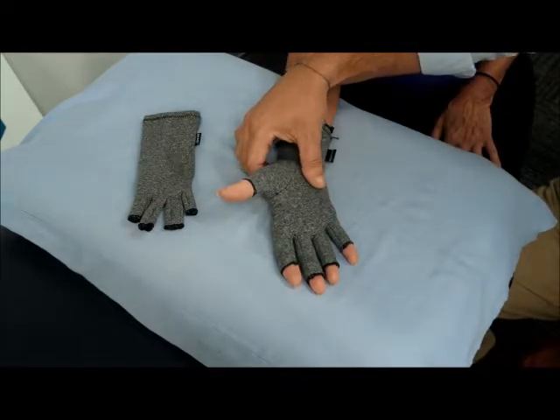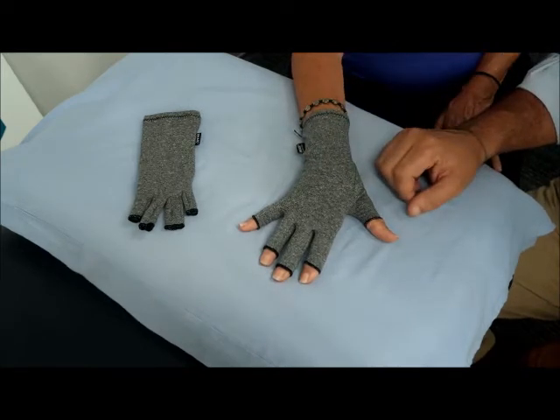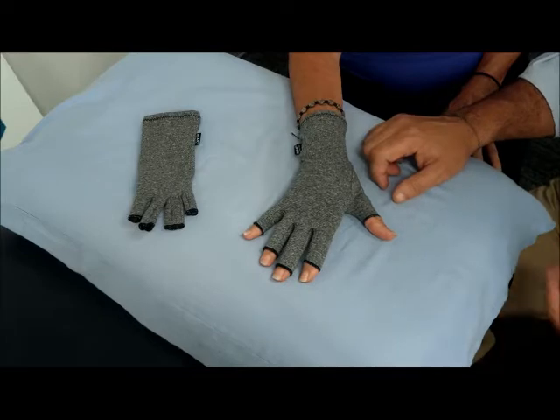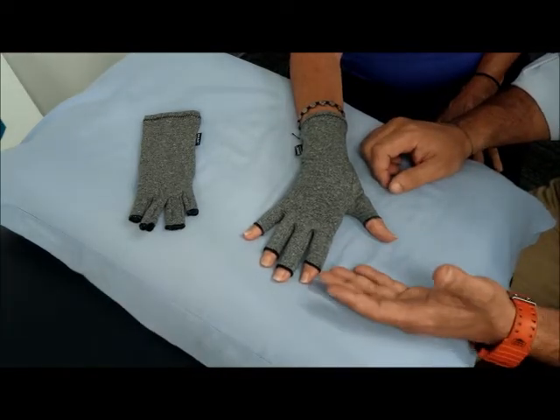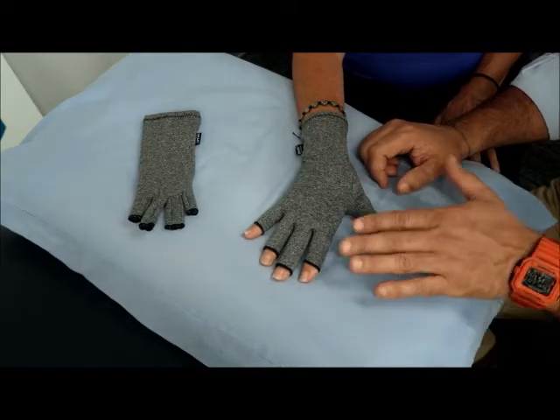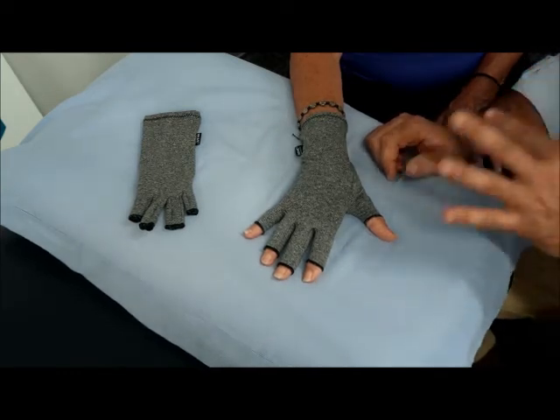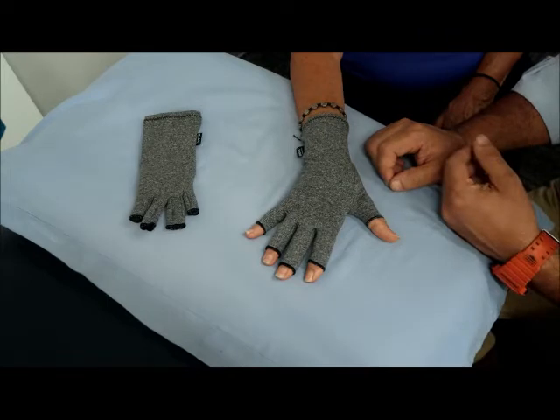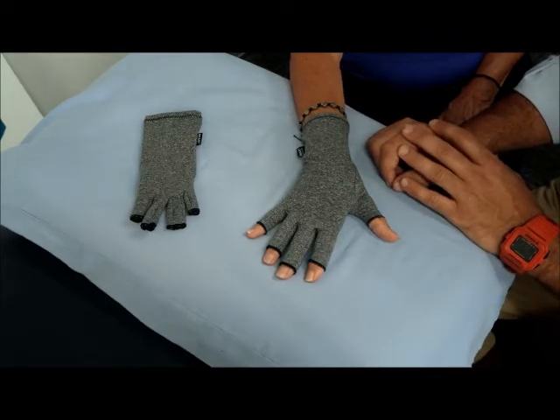They're a great item and a great glove. If you're looking at trying a pair on, I'd suggest going to your local physio or coming to Core Physio and making an appointment to get an assessment first, and then get someone to actually fit them on properly, because you can get them too loose. It's going to feel like they are too tight, but that's the way they need to be — it would definitely be worth getting someone to size them correctly for you.